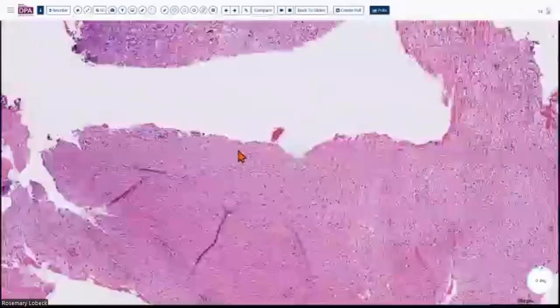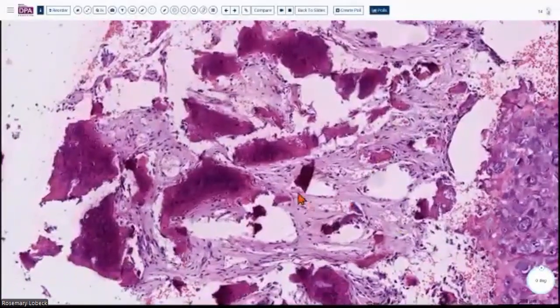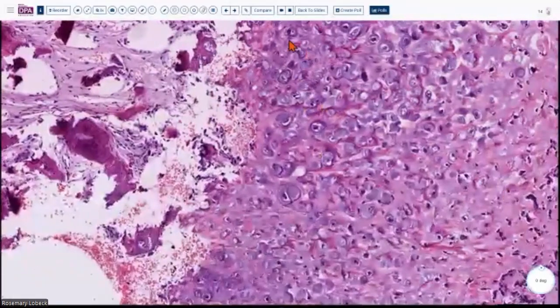So what about the bone then? Is everything okay with the bone? It seems so from low power, but there is some fibrotic tissue in between the bony trabeculae. Typically in osteochondromas, you see marrow. Instead here, you see fibrotic tissue. Maybe that's just reactive change, right? That's possible, but something is certainly wrong with the cartilage and the fibrous tissue.